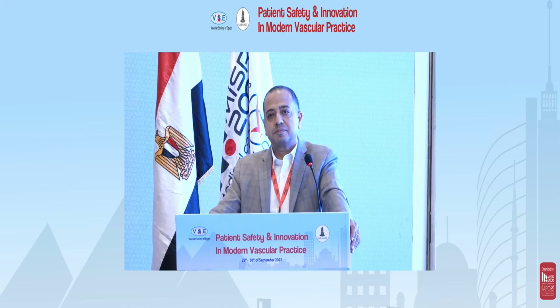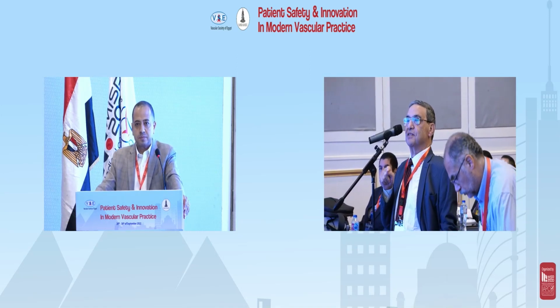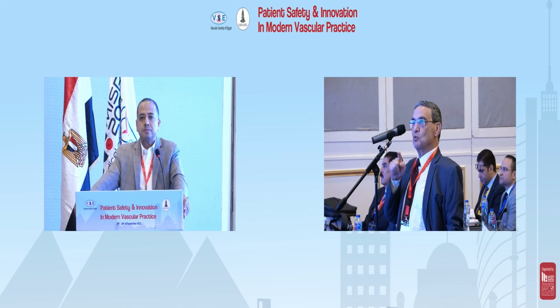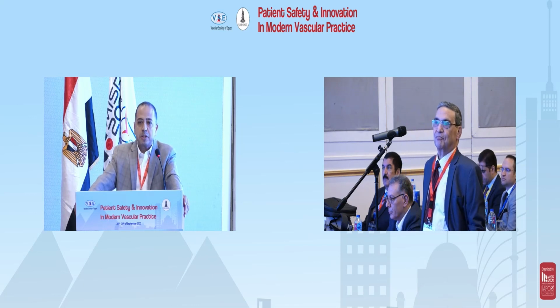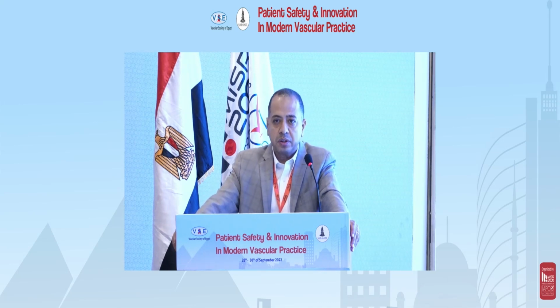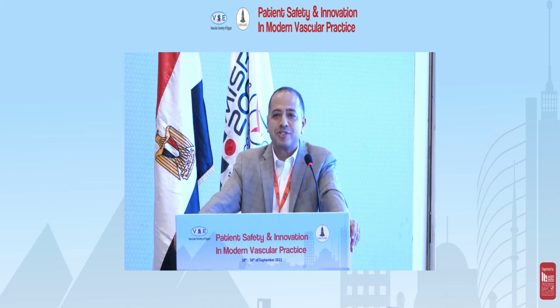Dr. Ahmed, in May-Thurner, IVUS may have another advantage because we usually get the upper end of the stent inside the IVC, but sometimes it goes further, including the other side. IVUS in this position may be very helpful to localize the extent of the stent inside the IVC. Okay, thank you. Yes, and I'm expecting Dr. will present in his talk tomorrow about veno-occlusive disease. I believe there will be a demonstration of what you said because it's really important in venous disease. But I didn't have a nice case to demonstrate.